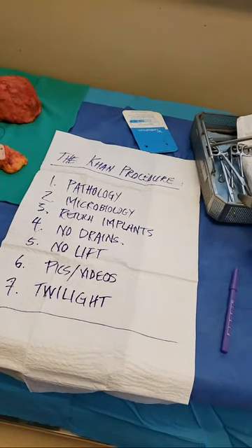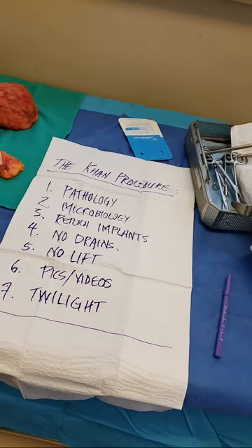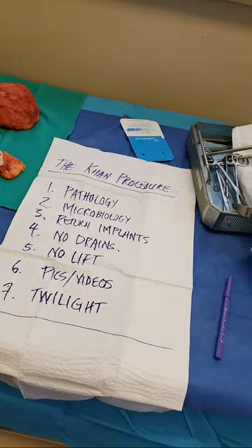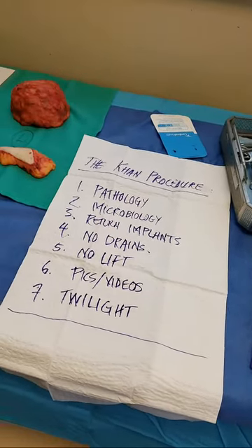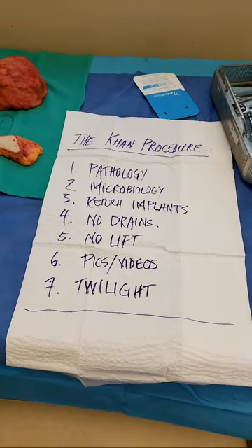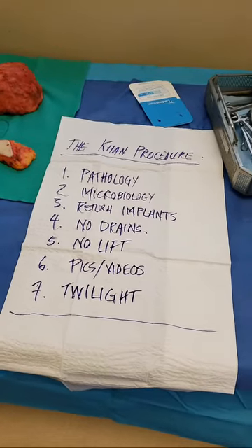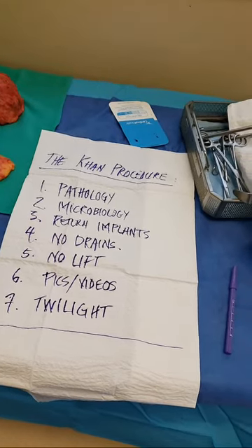This is how I do the surgery. The blood loss has been essentially minimal. This is not the time to be doing a lift. The patient had a severe contracture, as you can see, and a lot of inflamed tissue, especially given all the angriness and inflammation visible. I take high-definition pictures and videos showing the patient the chest wall — complete transparency. And lastly, the twilight anesthesia.